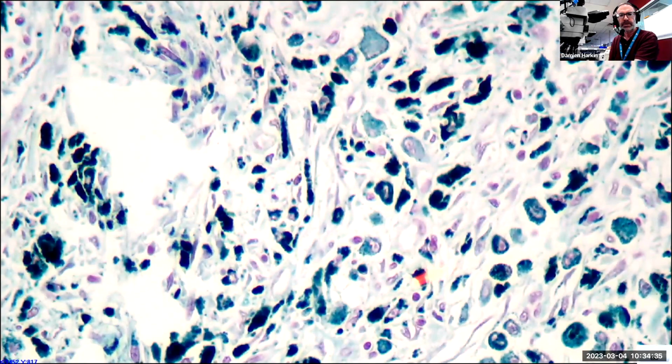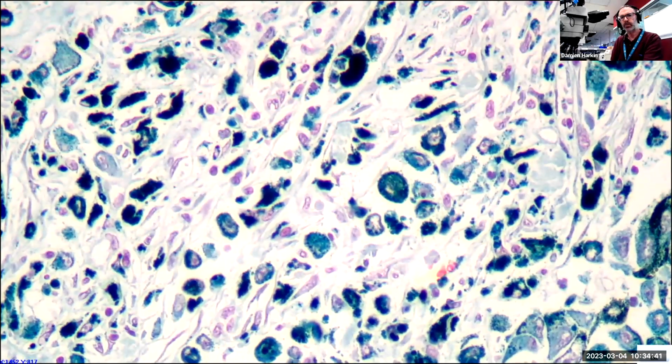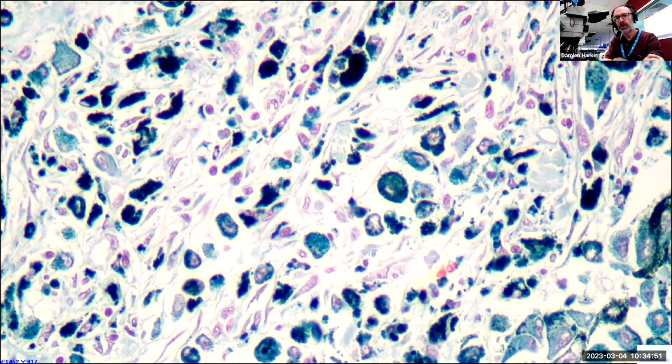And this is called Schmorl's stain, and it works on the principle of melanin having the ability to behave as a strong reducing agent. And in doing so, it is able to convert iron salts to this particular color that we can see here.